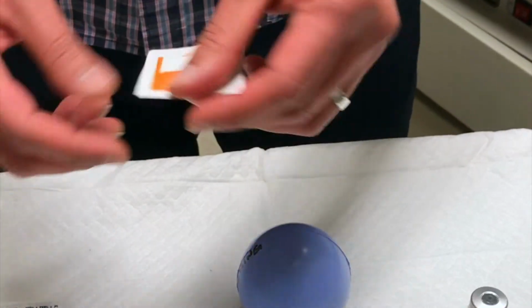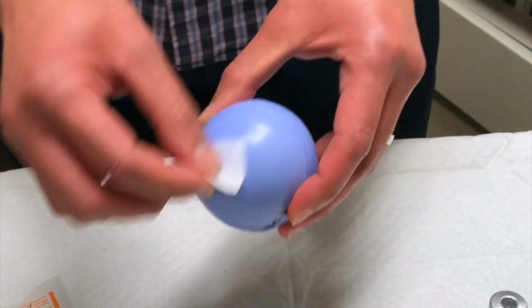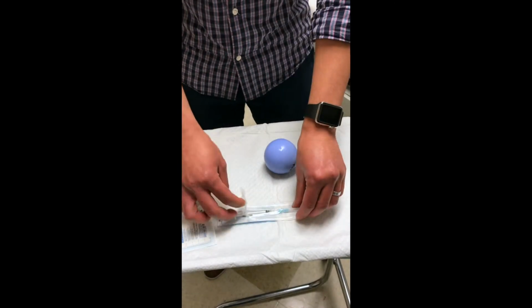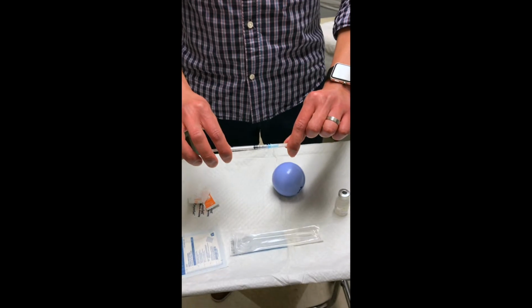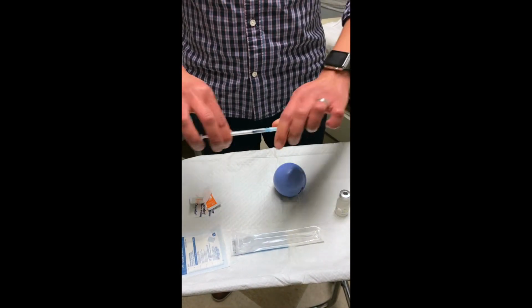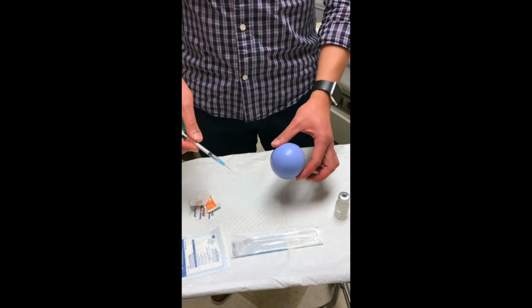So grab an alcohol swab, tear that open. Make sure you clean your injection site really well. And while that dries, we can get our needle and syringe ready. Same thing as when we were prepping earlier, it's a good idea to hold it at the ends and just pull straight back. Oops, that was a fail. There you go. Pulling straight back. And now this should be dry.